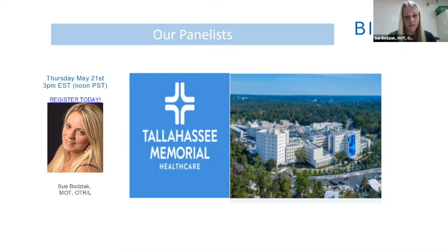So even if they're having a hard time with the evaluation tool, doing all the repetitions, you can easily modify it and just have them do fewer repetitions, and you'll still get a really good, thorough report, which is so important. But I'll use the evaluation tool then to decide what protocols to do with the patient, just depending on how they do. Do they have dyskinesia? Well, I'd use the error augmentation to make their movement look much bigger than it is, so they're able to focus on it.